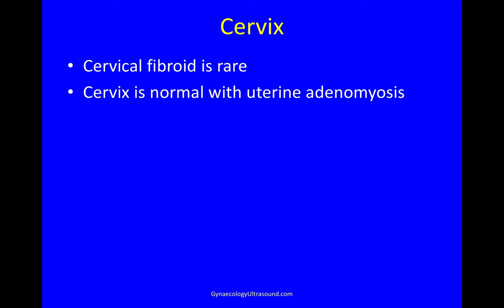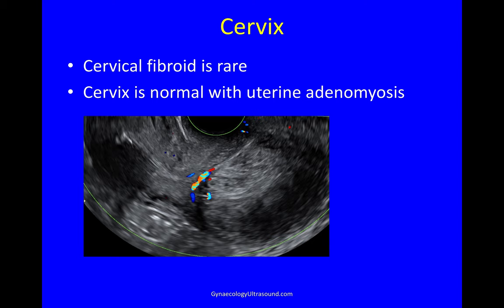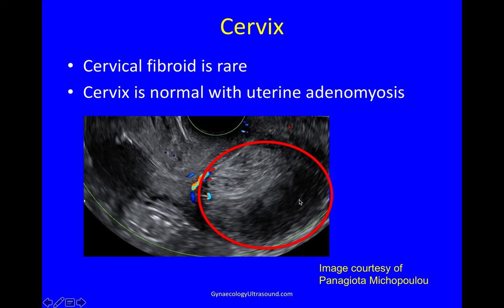Always look at the cervix. A cervical fibroid is rare and the cervix is normal with uterine adenomyosis. This is an example of a cervical fibroid — a transvaginal image of an anteverted uterus showing the anterior wall, fundus, posterior wall, and a mass within the cervical stroma below the internal os. You can clearly see this regular, slightly hyperechoic mass in the stroma of the cervix — not in the canal — with some peripheral vascularity and shadowing. This is a cervical fibroid.